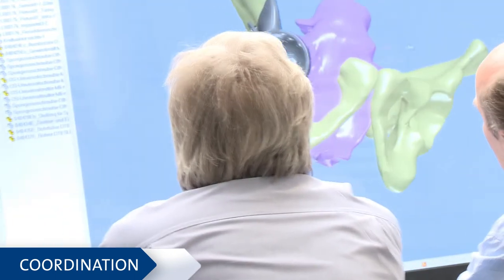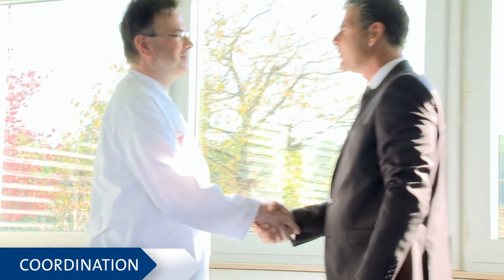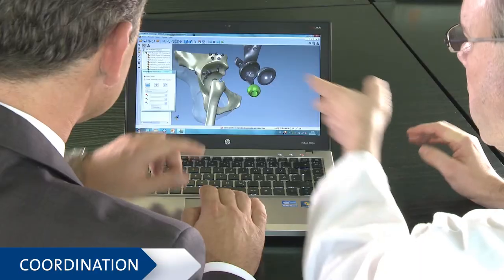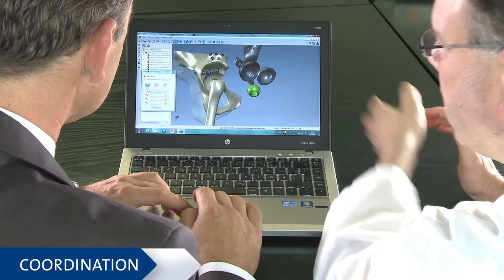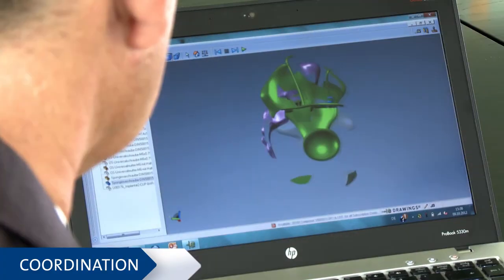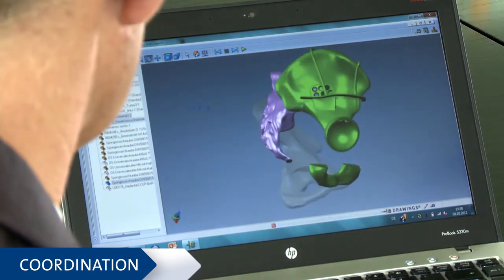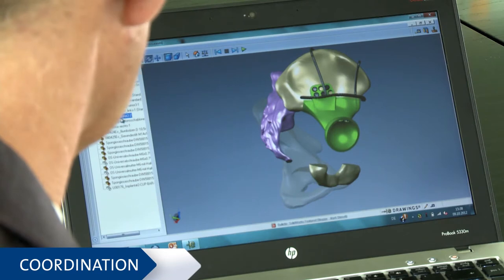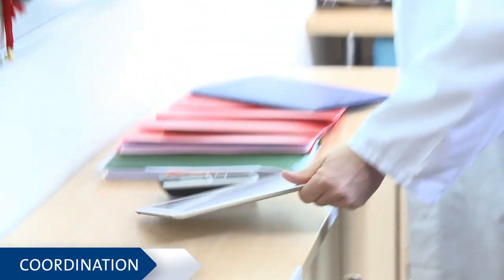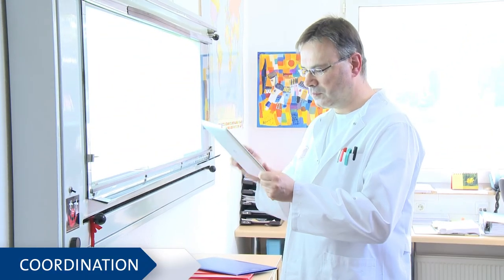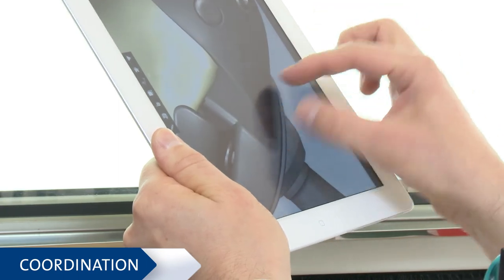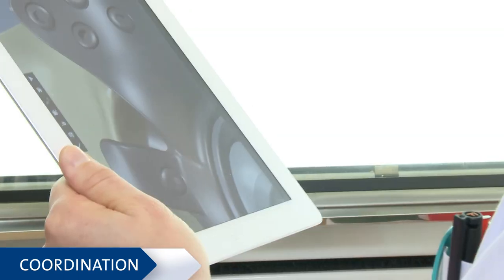Every case is discussed by the team of AQ Implant specialists. Throughout all planning stages, we place great importance on close consultation with the attending surgeon. With our 3D visualization software, the model is projected into the patient's bony anatomy. The program enables the surgeon to actively participate in the design, providing utmost preoperative planning reliability.